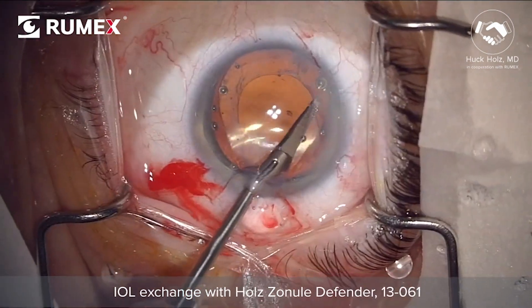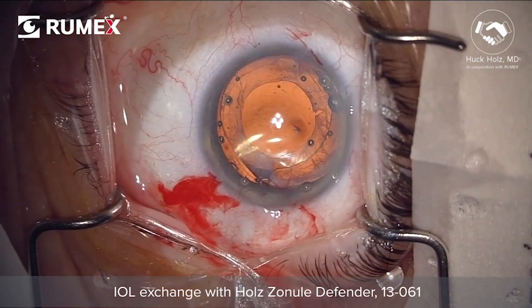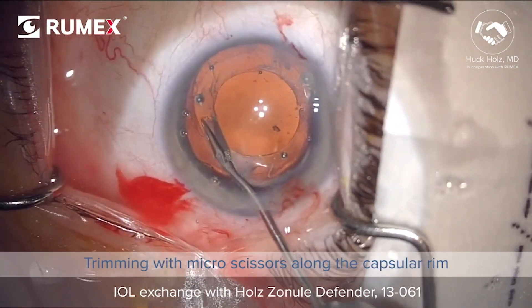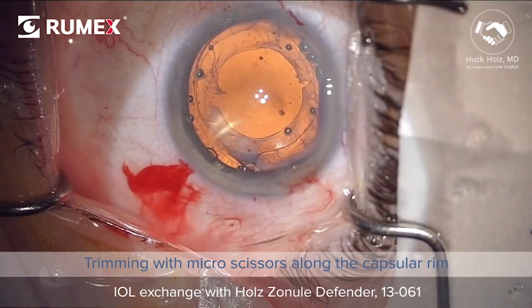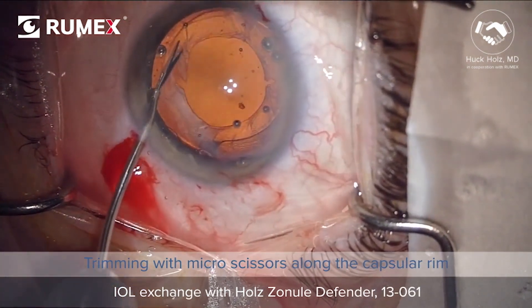Making several nicks along the capsule rim and then gently tearing or slicing these fibrotic bands will help you elevate the lens through the capsule bag with less trauma to the capsule.